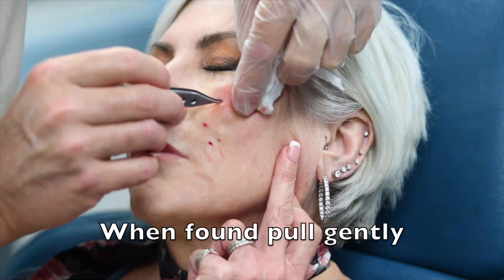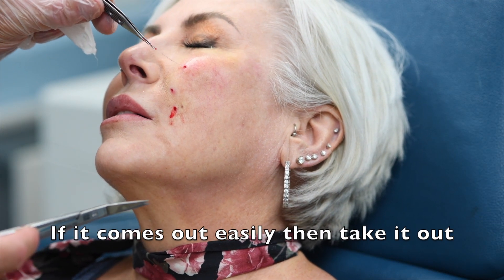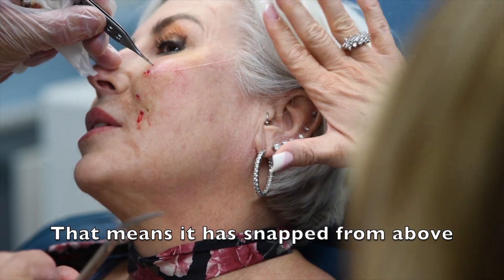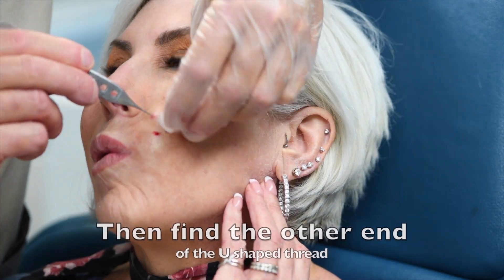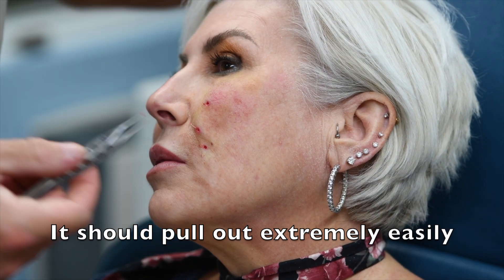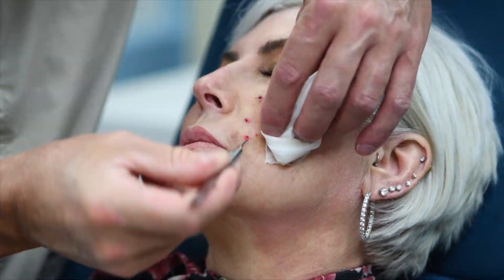You really don't have to go more than a couple millimeters. The patient will actually help you find them — listen to what she says and you'll find them. If it pulls out extremely easily and the whole thing comes out, then you know it actually snapped right in the temporal area where the temporal needle got it two and a half months prior, but now it finally snapped because it was weakened. Now you have to find the other end of that U-shaped thread, and you should be able to find it where she tells you. It should pull out extremely easily because it's the other end of the thread, and it snapped at the top.